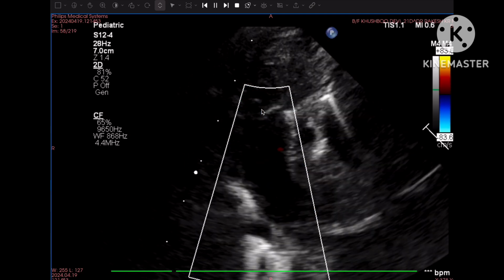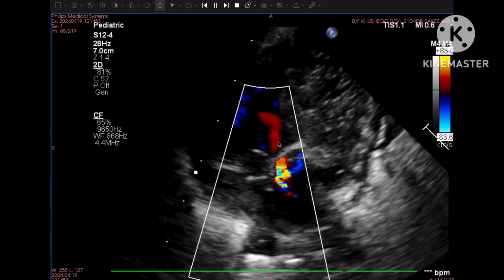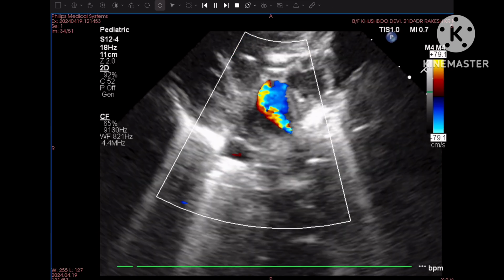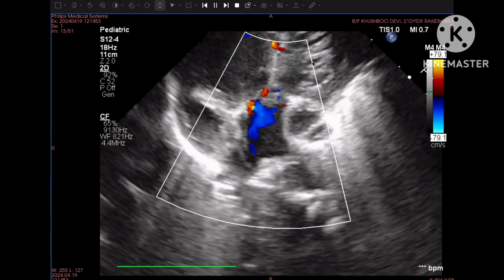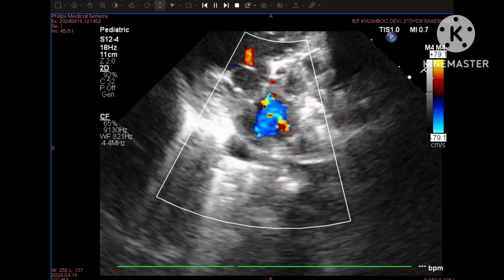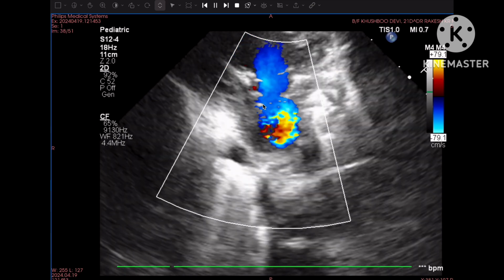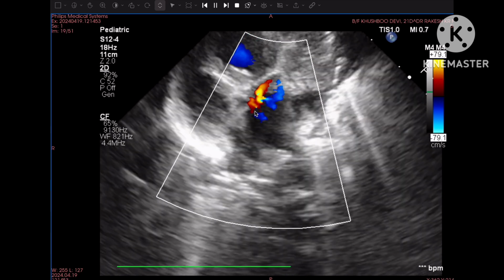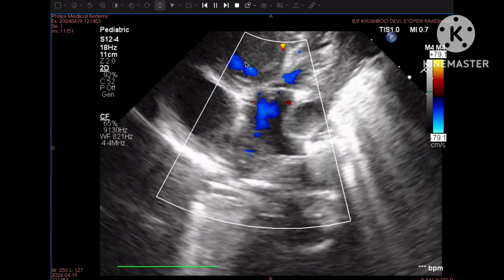Again this is the aorta, aorta is coming out of right ventricle, no outflow obstruction, and this is pulmonary artery with patent ductus arteriosus. Now see this is pulmonary artery with PDA, it shows left ventricle, then aorta, and then right ventricle with aorta, left ventricle pulmonary artery and right ventricle with aorta. This right ventricle aorta. I want to stop.